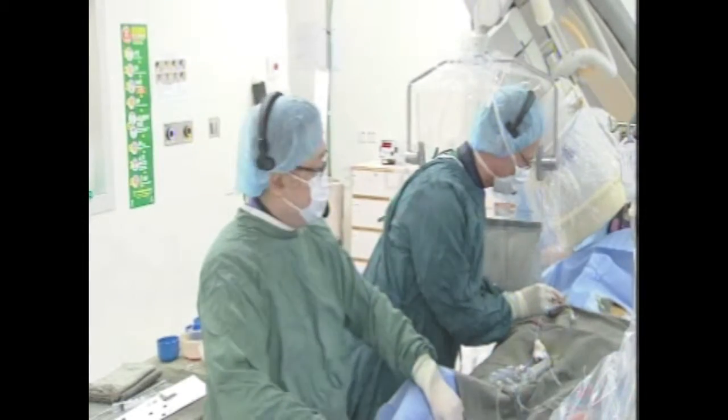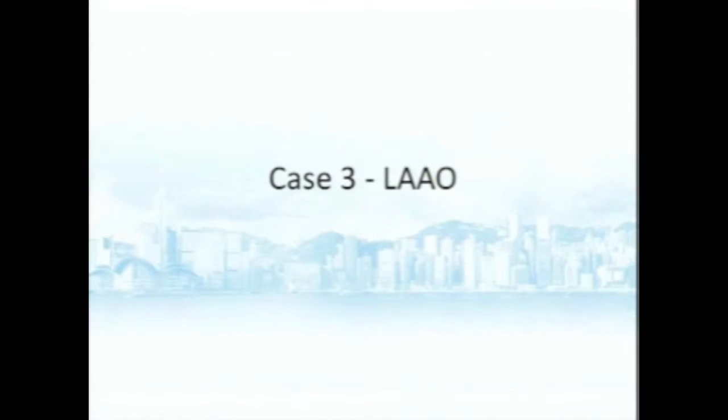So we are going to have left atrial appendage occlusion in this lab. Maybe Dr. Choi can present the case for you. Okay, so this is a case of LAAO.